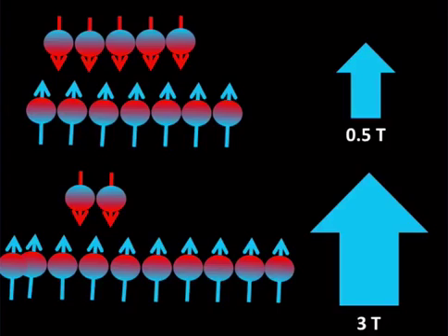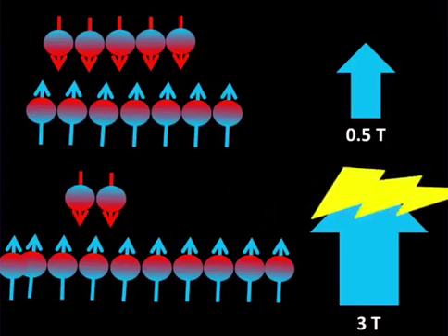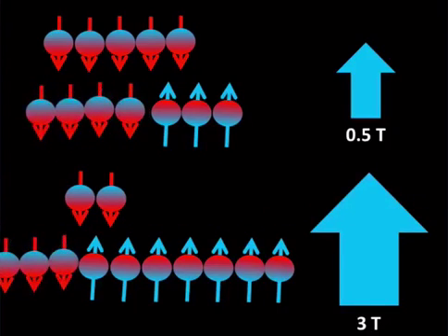In other words, it takes some of the hydrogen atoms that are directed with the magnetic field, and flips them so that they are directed against it. Sort of like this. See that? See how we had change? And notice that less of them changed at a higher field strength relative to this one, if we use the same pulse, so more of them changed here.